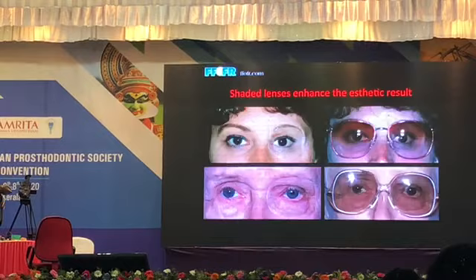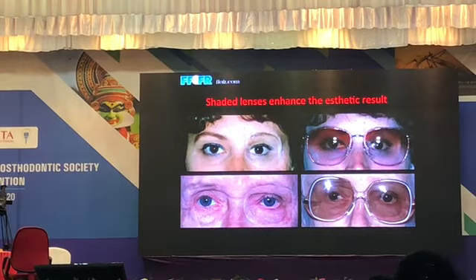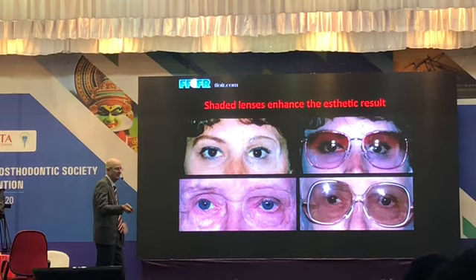Here's another couple of outcomes. This shows you the value of shaded lenses, and we use a lot of shaded lenses to help camouflage the appliance. And when you have a shaded lens like this, you can't tell that the patient is wearing a prosthesis at all.